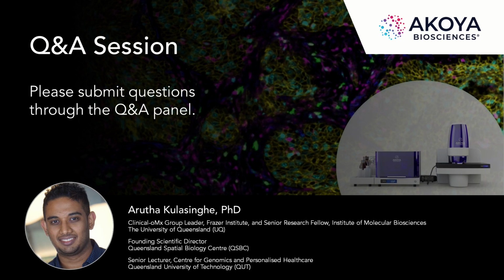And when we have the lymphoid-like aggregates near the periphery or within the tumor, we demarcate them as tumor-associated or TLSs. There's a lot of work that Julia Bruno's done in the field where they're using multiple markers, CD19, CD20, CD21, the structure of these TLSs. We're looking at the transcriptomic data, so comparing the RNA between germinal centers and TLSs at the moment. So it's an integrated approach at the moment based on pathology readout, multiple markers, where in the tumor is it, is it very far from where the tumor is. So we're using multiple ways to differentiate it.